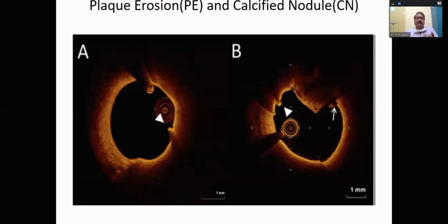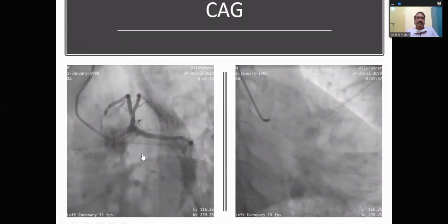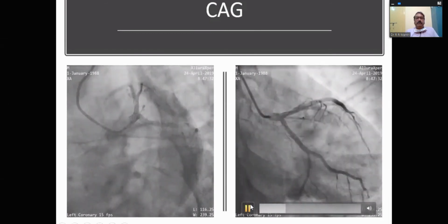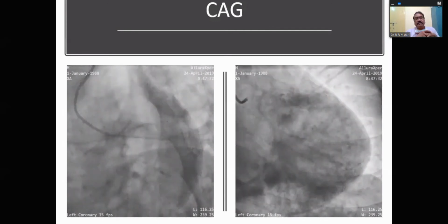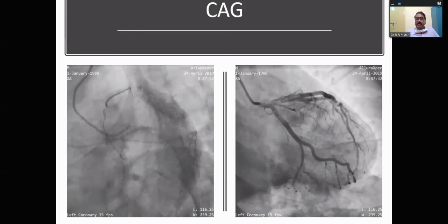So I will quickly go through three of my cases. Case one is a 30-year-old male, history of acute MI. This is the ECG at presentation and before the study. Initially managed with LMWH and DAPT and then taken up for angiography. And you can see there is a filling defect in the proximal LAD. So even in the absence of OCT, probably most of us would have treated this case conservatively because there is no flow-limiting lesion. But OCT has given us a better understanding.